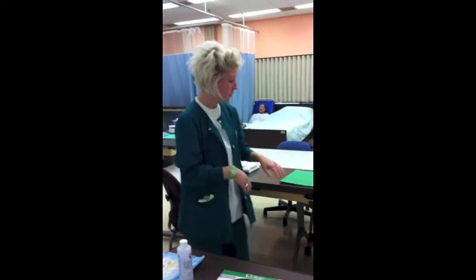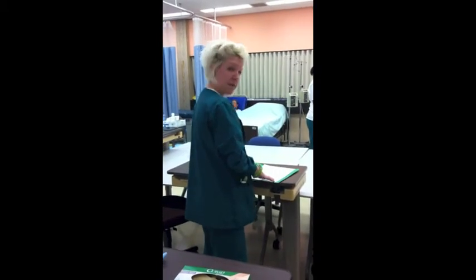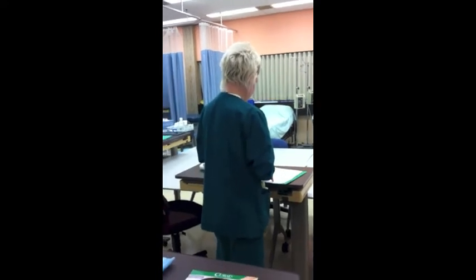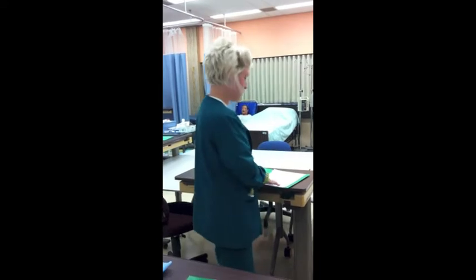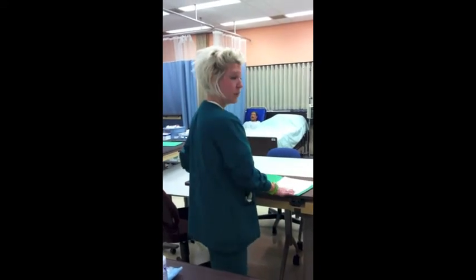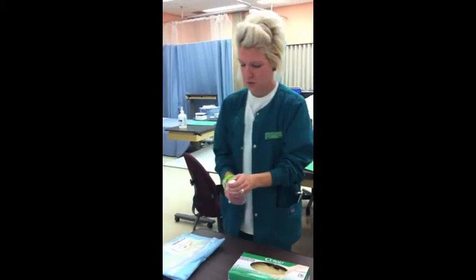I'm first going to do a focused assessment on the abdomen. I'm checking the order to ensure this is the correct person, Allison Alvarez. The order is for ostomy care every shift, change pouch every 5 days. It's the 5th day, so I'm going to do the change. I'm going to enter the patient's room.